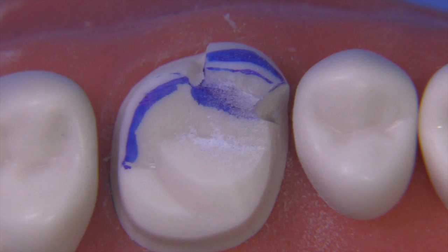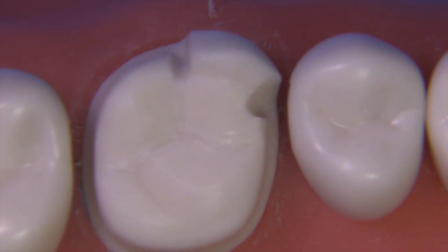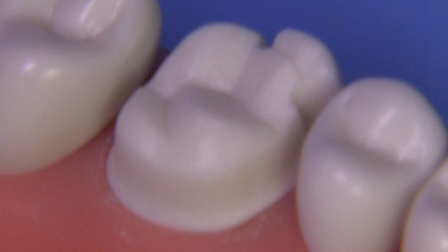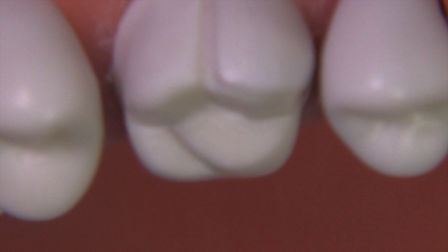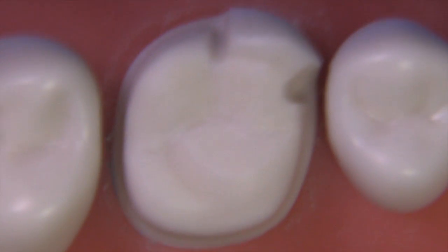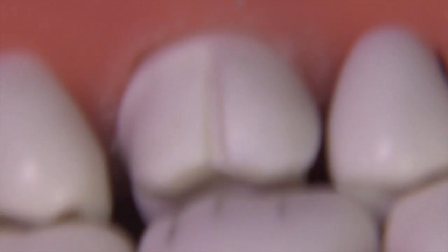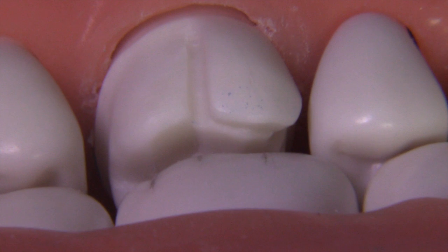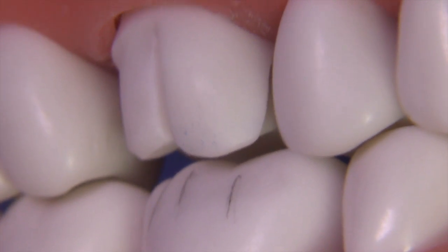At this point the preparation is pretty much done. We have plenty of retention and resistance form. I've tried to make it smooth — sometimes it's helpful to use hand instruments like chisels, hoes, and hatchets to make things a little bit cleaner. We have the final preparation done. When you look from the facial, it's kind of cool — you're not really going to see the gold when it's in the patient's mouth. The clearance on the mesial facial is 1mm and 1.5mm on the distal facial; of course, the lingual cusp has 1.5mm of clearance.